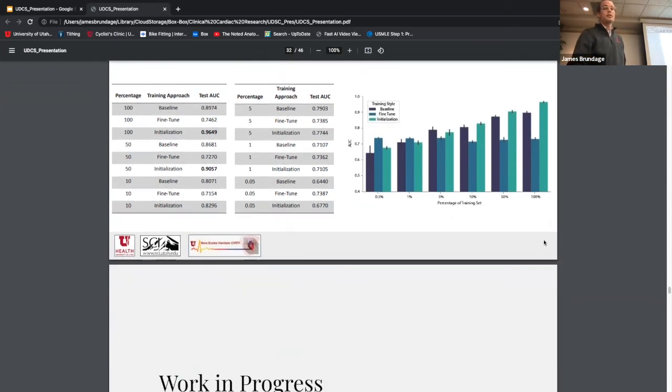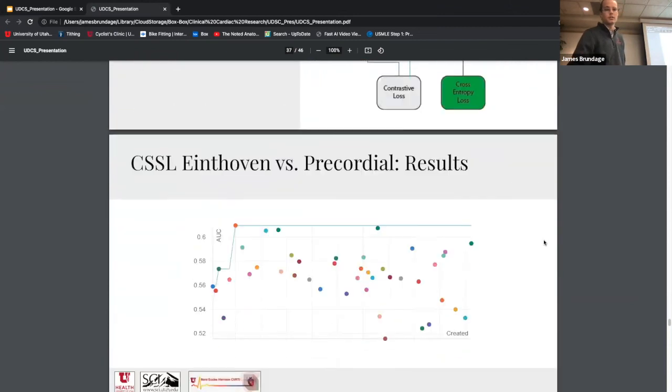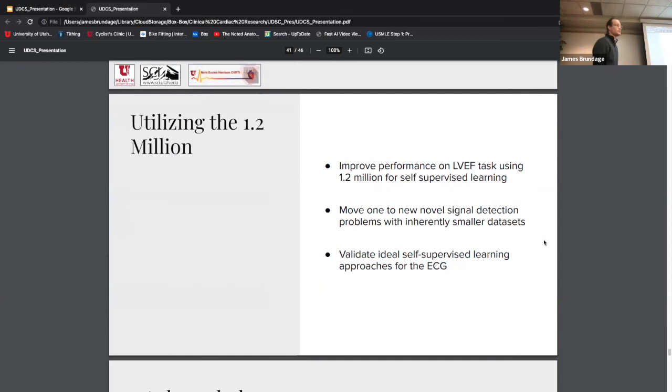Yeah, really briefly, what I'll say is it's work in progress. What we're trying to do now is use more contrastive learning processes where we don't need any data labels at all. We're trying to use these contrastive processes that learn differences between different leads, between different times, between different patients, using that as our initial pre-training task, and then having that be the basis for the feature extraction. Spoiler alert, we're still working on it, we haven't gotten it to work yet, but that's my current work.